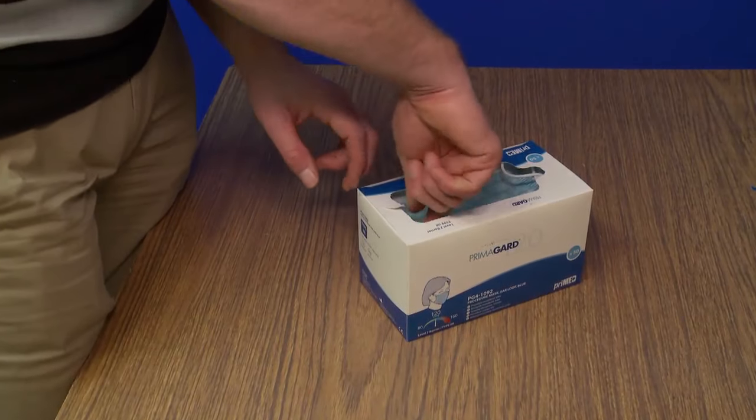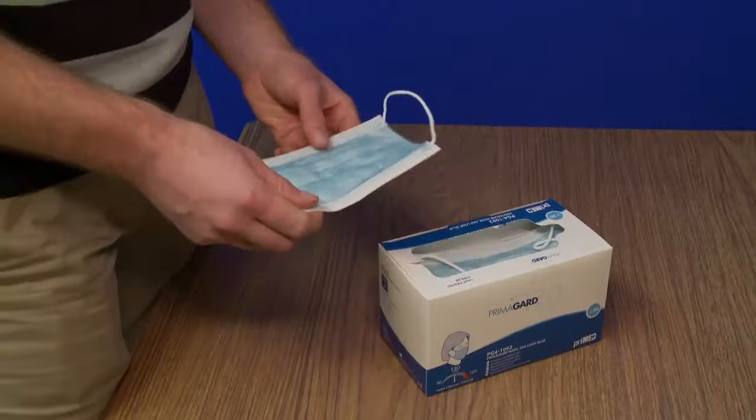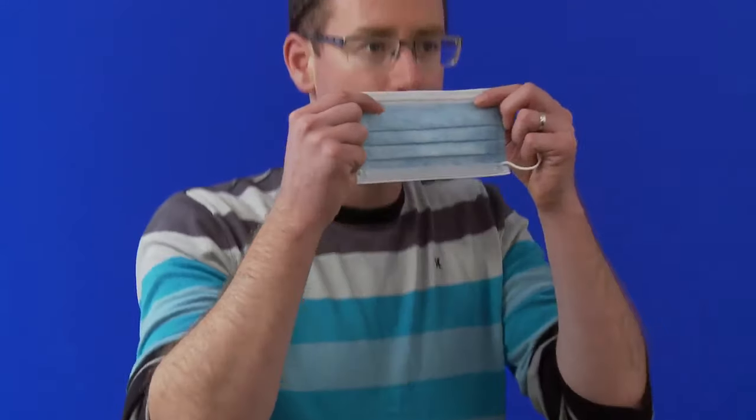Take a mask from the box by its ear loops and check for tears in the mask. The coloured side of the mask faces out. The bendable metal edge is the top.